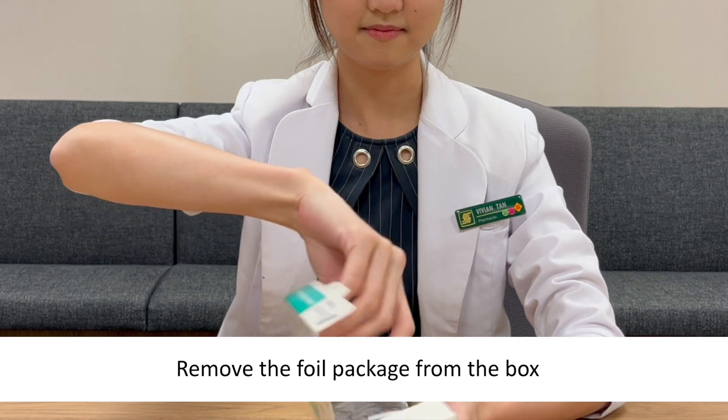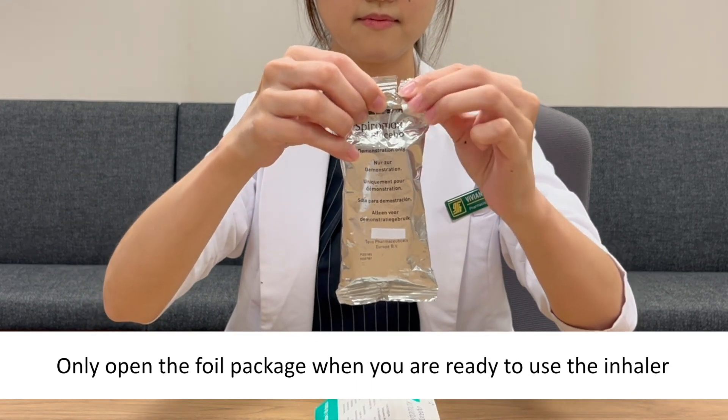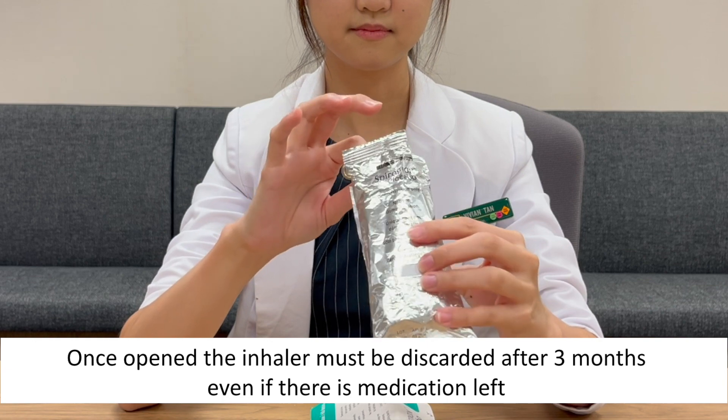Remove the foil package from the box. Only open the foil package when you are ready to use the inhaler. Once open, the inhaler must be discarded after 3 months, even if there's medicine left.